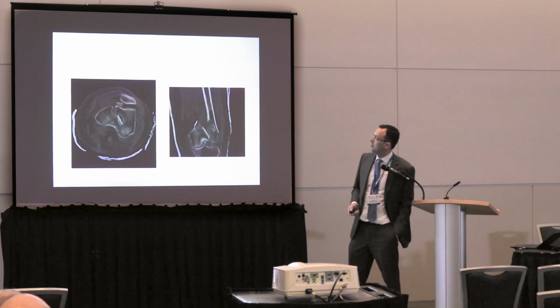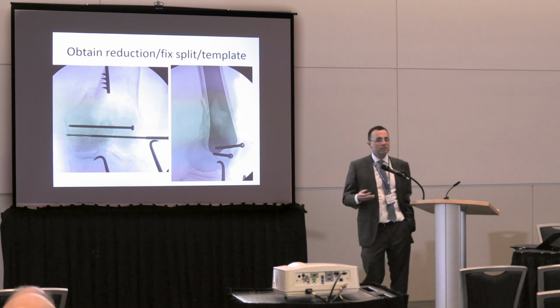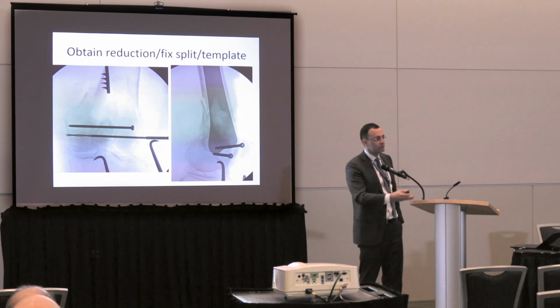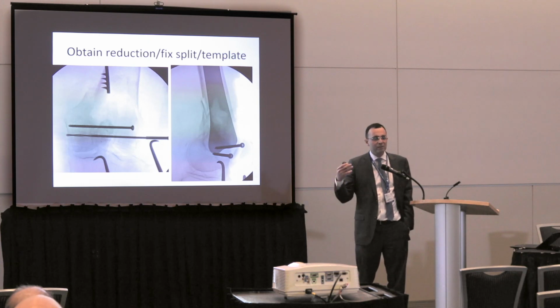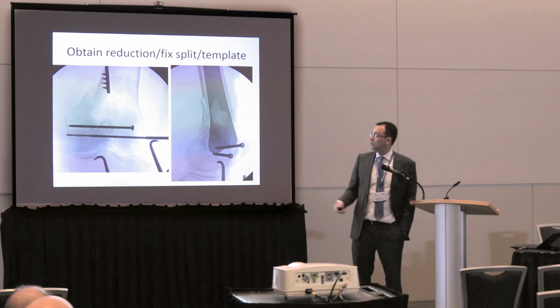So this is an 81-year-old female. You see a relatively simple split. And this is, I think, one of my hesitancies, and a lot of people's hesitancies: how are you going to find the holes? You just don't want to deal with it, right? You just want to avoid doing something that's a little different. Maybe I was frank, that was my reservation. Well, I'm here to tell you this is as easy, if not easier, than what you're typically used to.